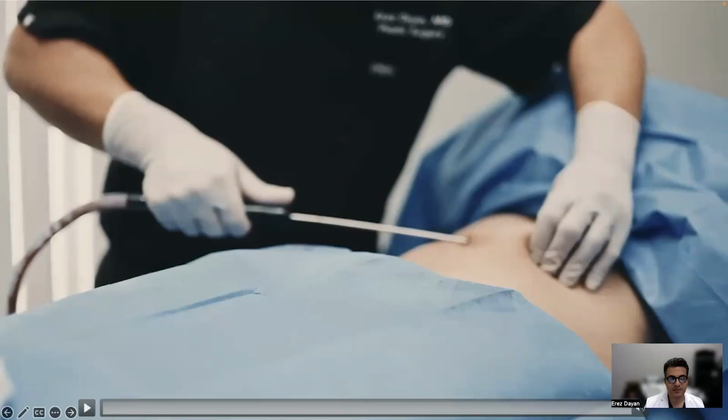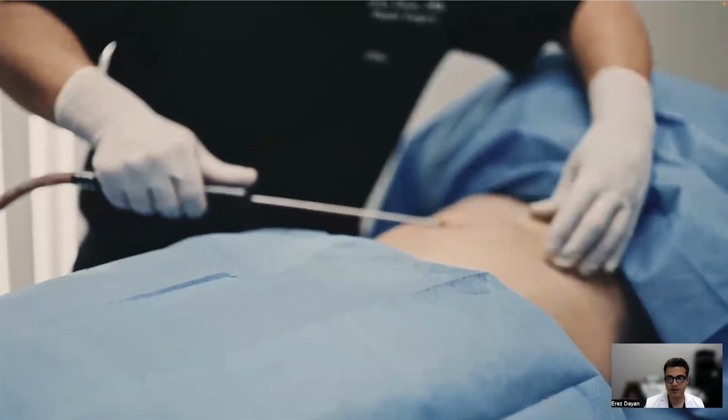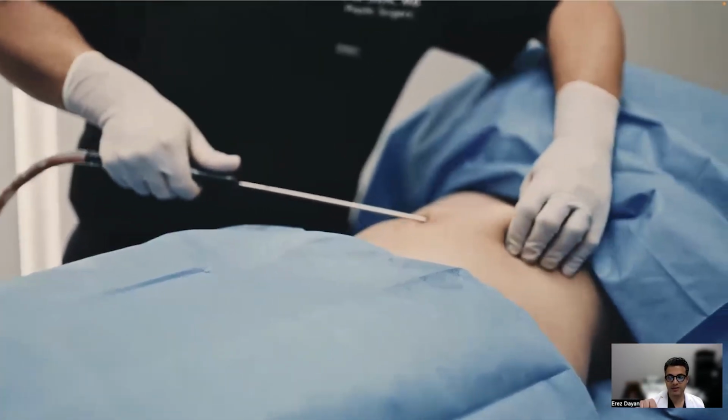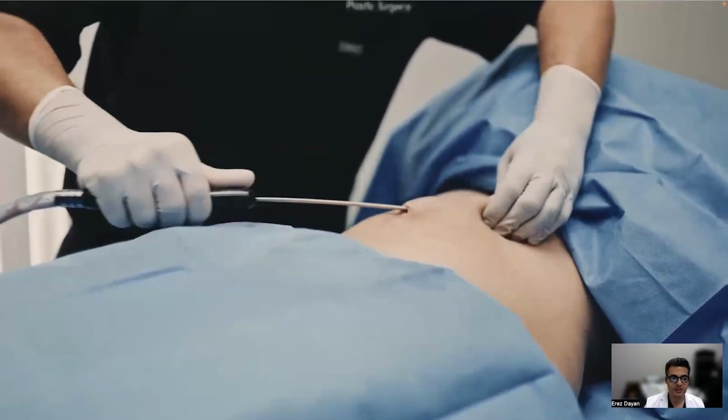And here's this hot dog method I described. So what we're going to do is kind of hot dog the skin up, and then I'm liposuctioning in a U shape, and it allows me to also pinch and assess how thick my skin envelope is. So I'm taking long strokes.